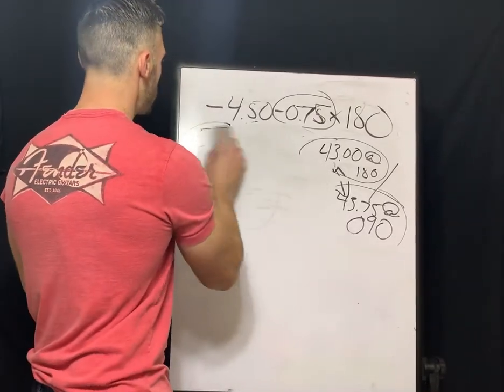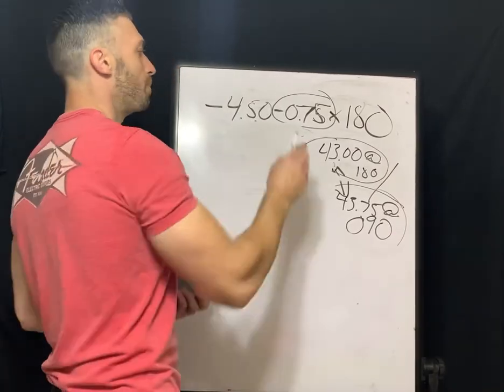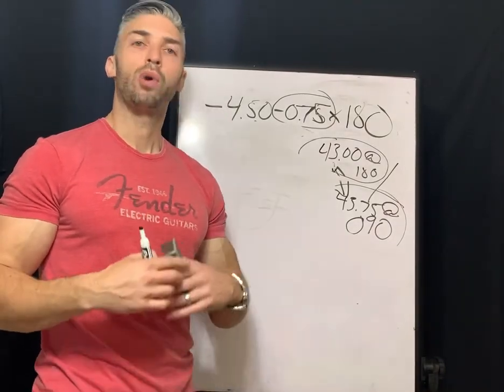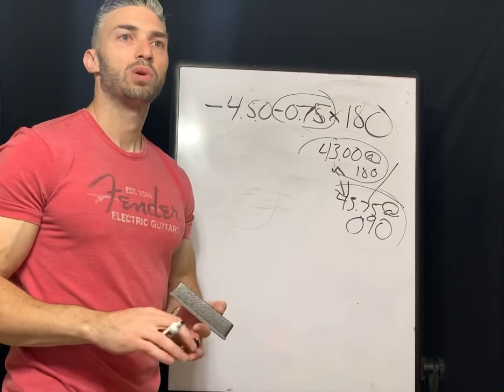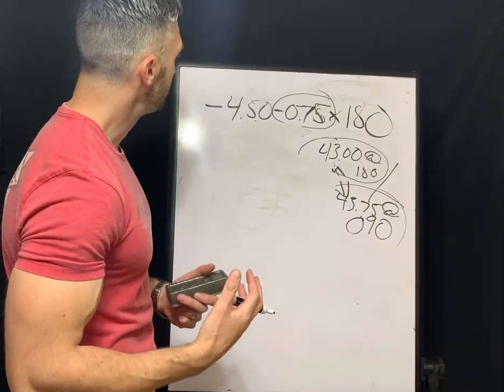But we don't need to transpose this because it's already given to us in minus cylinder form. And you have to remember, if you get a prescription in plus cylinder form, the first thing you want to do is put it in minus cylinder form. We always work in minus cylinder form. So it's in minus cylinder form. Good deal. Next, we're going to remind ourselves what type of lens we can fit with this.